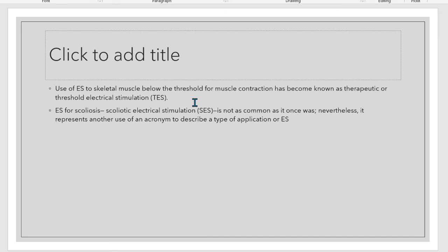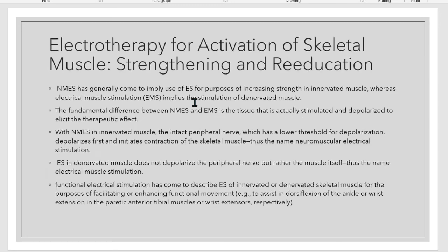Sa una, pero because of the advent of modern techniques in treating the scolio, nawala na ang ES. But of course, there are some other doctors that still use this kind of technique in treating scoliosis. Some physiatrists still order ES for scolio instead of prescribing only exercises.